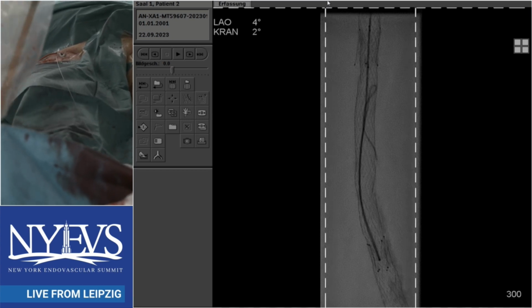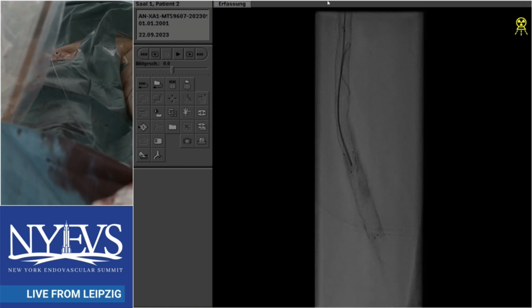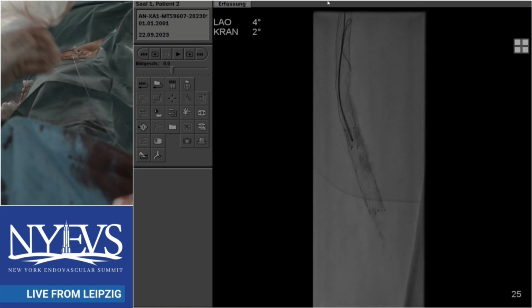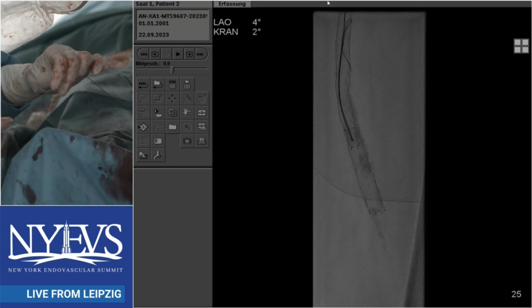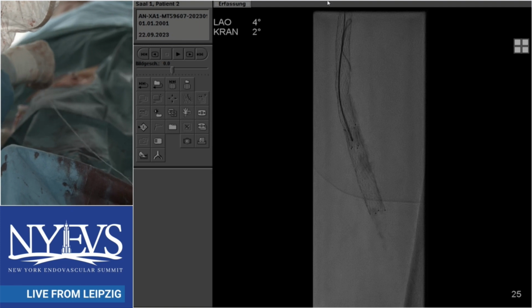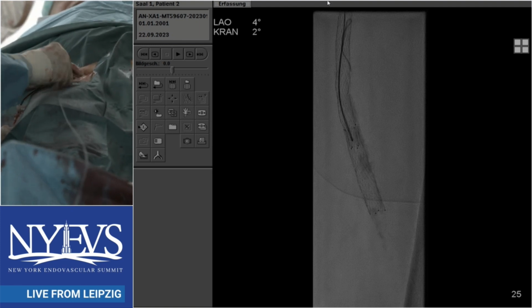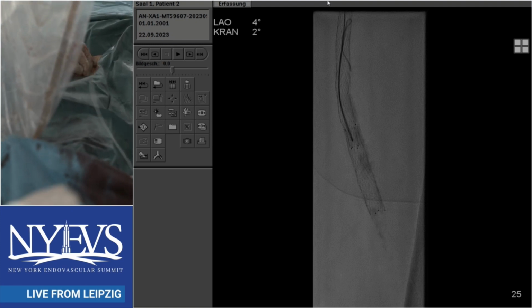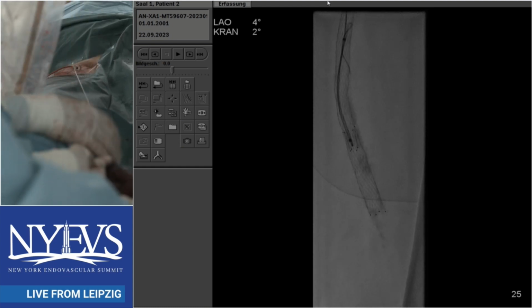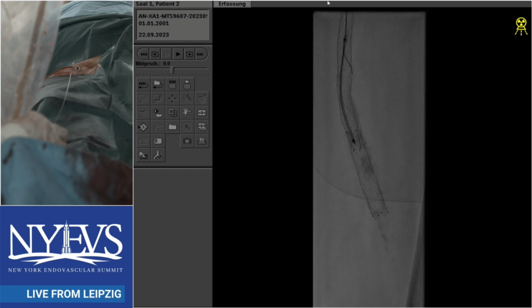And again, you're talking about a procedure that needs to be durable to keep him walking for a long, long time. He already has shown biologically he's not a durable patient. With all due respect, at the end of this case it's going to be, I'm sure, perfect. How long is it going to last? Well, that's what I'm wondering, because I've seen my DVA patients resolve their rest pain. So if he develops that, maybe getting more outflow at the same time of the intervention may provide some more patency to whatever the above knee is.